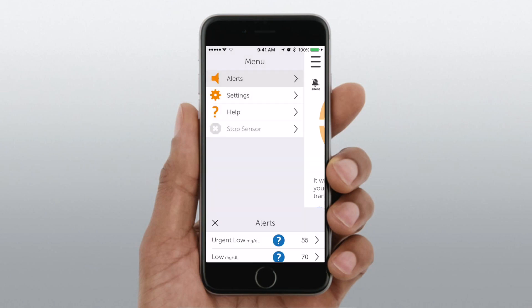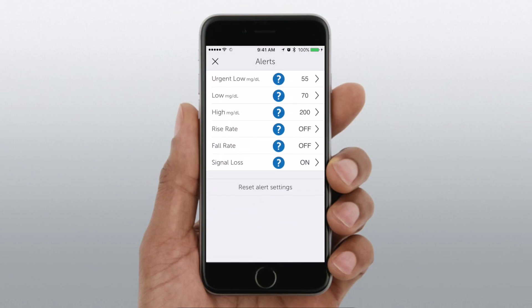We're going to swipe open that left menu on the left-hand side. We're going to check out alerts. You can customize all of these alerts just like you could on the receivers. You can set the rise rate alerts as well as the low, the fall rate alerts. And you can customize these to any points that you'd like as well as any rate at which you would like.